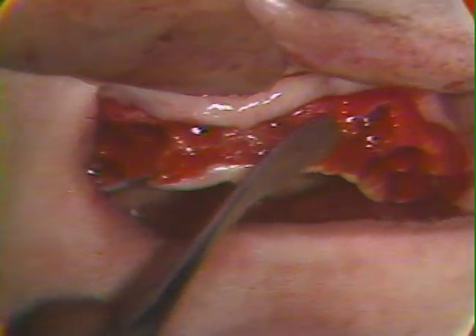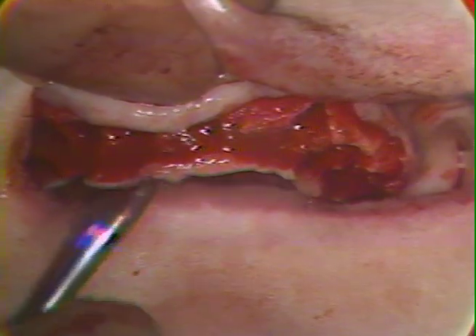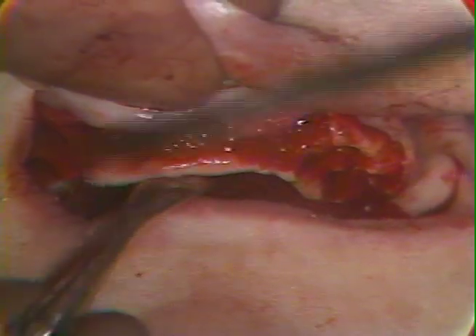We have removed the periodontal pathology. We've removed the periapical pathology with curettage, taking a small curette and going up into the alveoli. Now we'll bring these landmarks together. First of all, we'll anchor the midline just as we did before with our initial suture right in the midline.